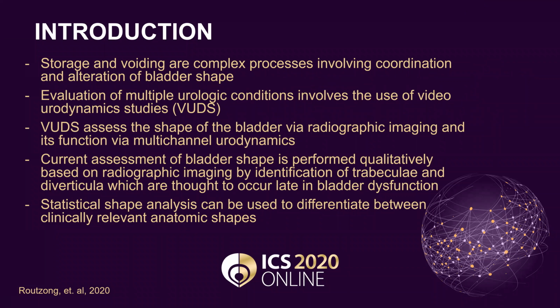Storage and voiding are complex processes involving coordination and alteration of bladder shape. Evaluation of multiple urologic conditions involves the use of video urodynamic studies, called VUDS. VUDS assesses the shape of the bladder via radiographic imaging and its function via multi-channel urodynamics.